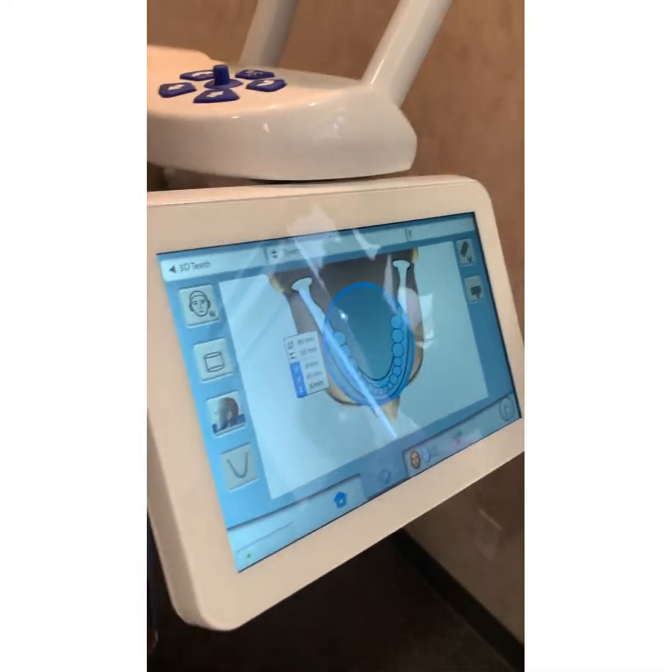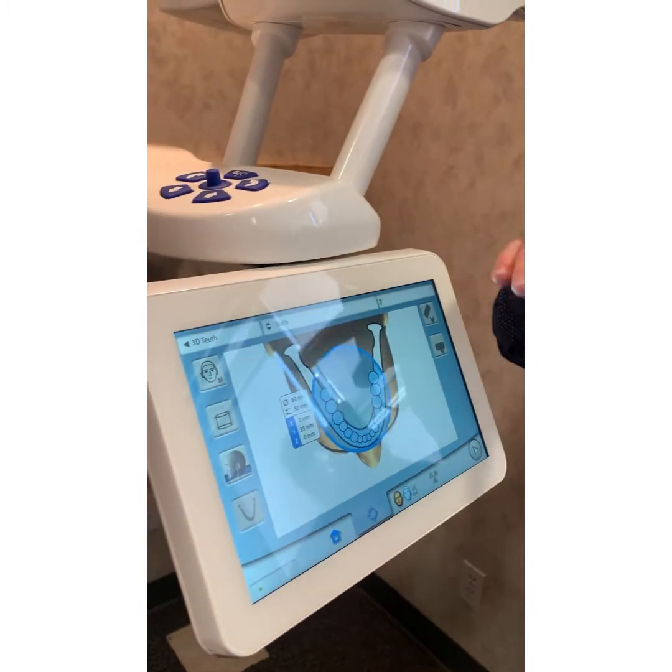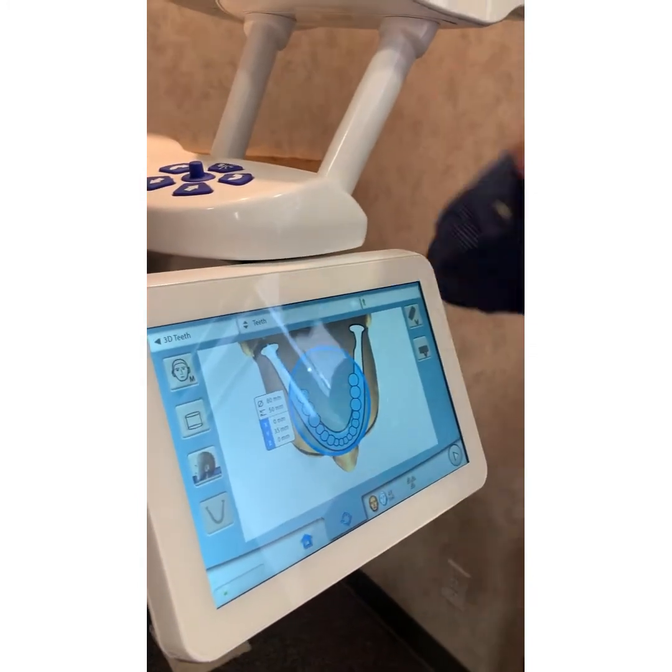There's nothing wrong with taking a 10 by 10 on everybody, depending on what you're looking at. But as you get better at targeting, there's nothing you can't just focus in on if you want.